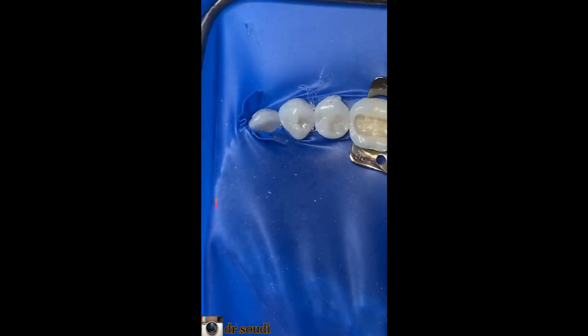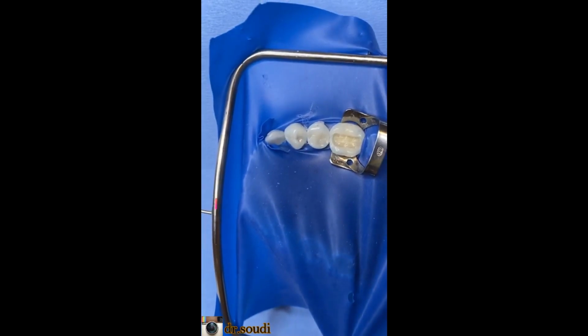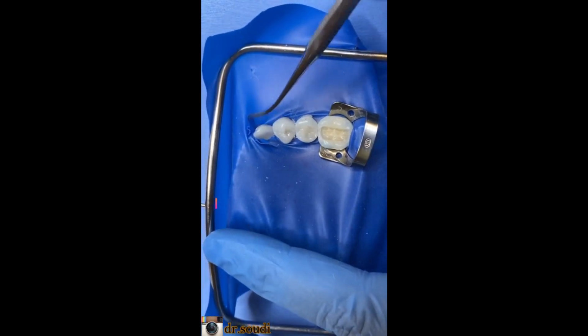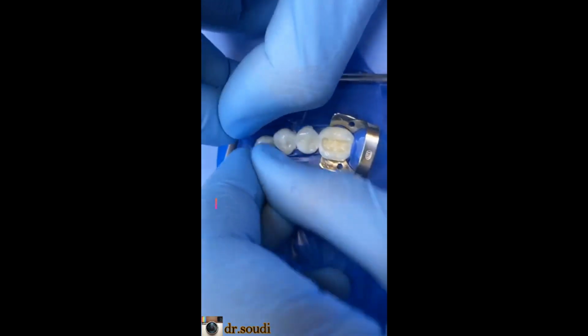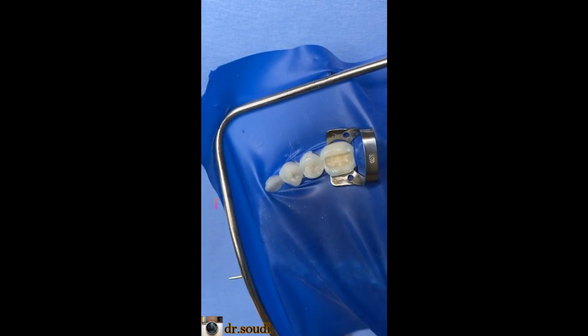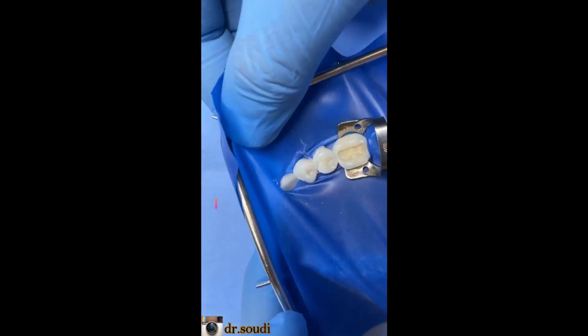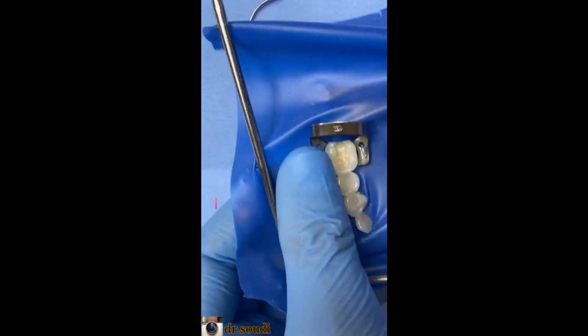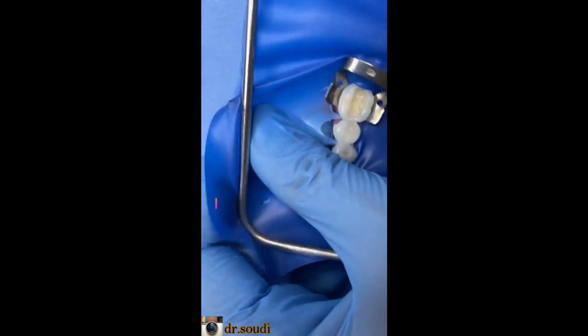Now, removing the rubber dam: always start with your end. That means I placed this at the end, so I should remove this one first, and then like this. Okay, and then for a safe removal, don't remove it like this, no. For the safe removal, stretch it like this.